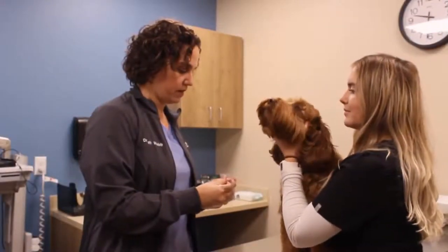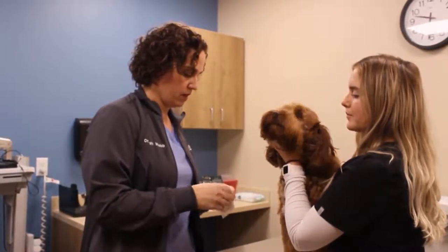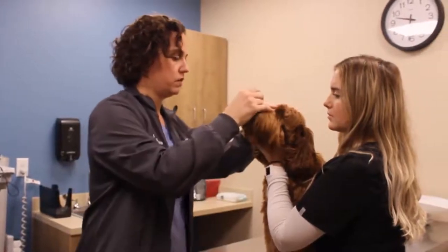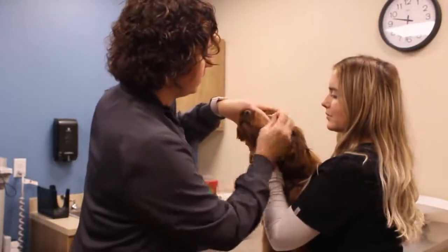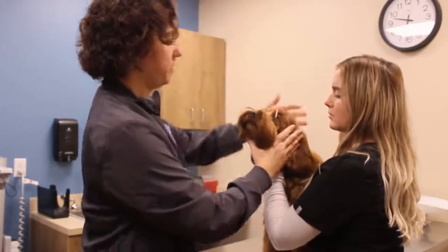We're going to start by measuring Max's tear production. These little strips will go in and collect his ability to make his own natural tears. They stay in for about a minute and it's not painful while they have this tear production measured.